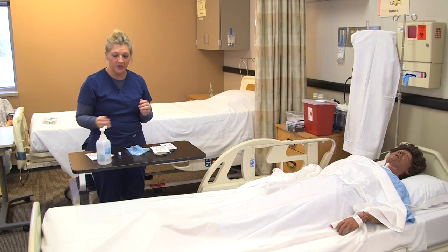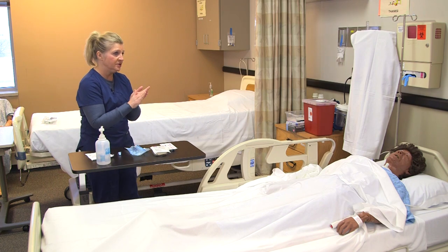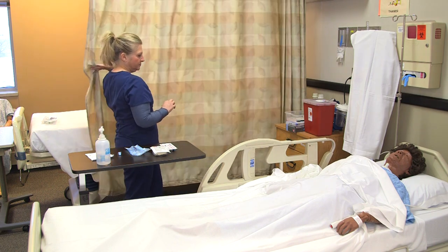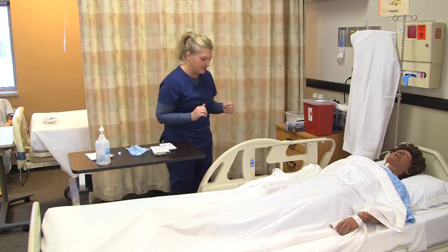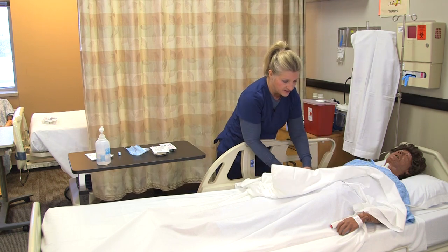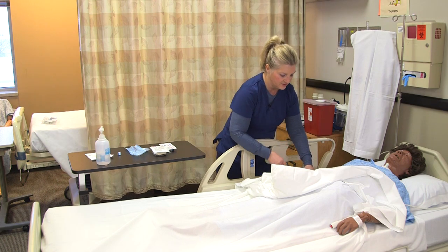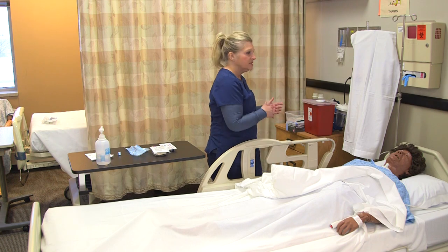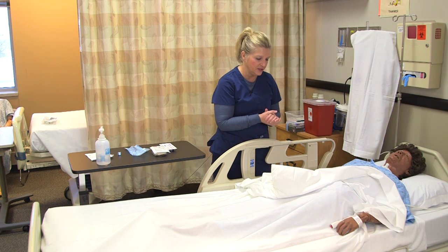You come into the patient's room, wash your hands, introduce yourself, provide for privacy, and then do patient identification. Check the patient's ID band and confirm with two identifiers — asking for full name and date of birth. Also ask for any allergies, and double check with the EMR to make sure you have the right patient.